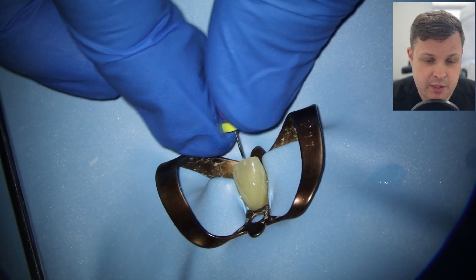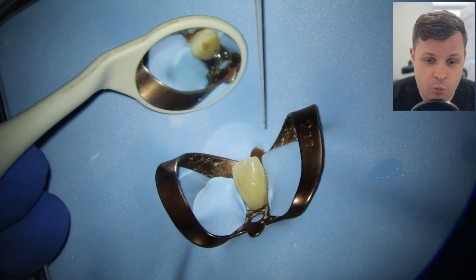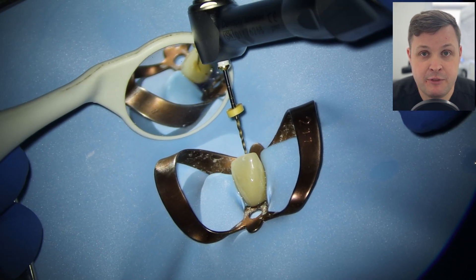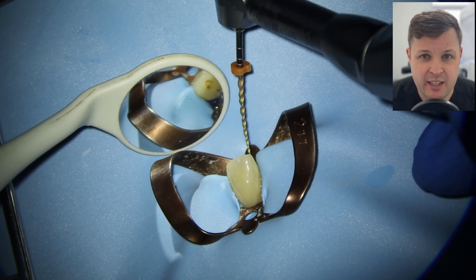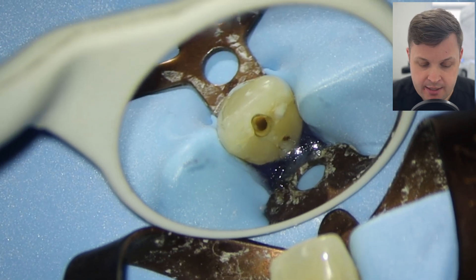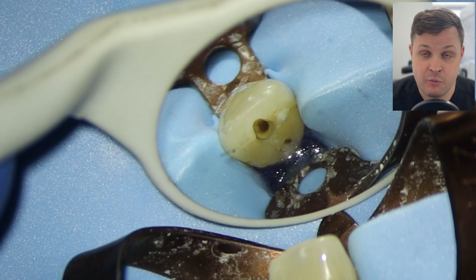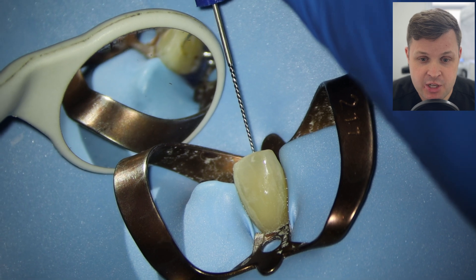Once I've confirmed the canal space is open, I'm going to use a size 10 K-file with a very acute bend on it just to get into the orifice, then use a watch-winding motion to open up the coronal orifice. Then I'm going to use my size Hyflex 1503 file to open up the orifice a bit more. If the coronal orifice isn't open before you get your working length, opening it afterwards will affect the working length because you're essentially shortening the length the file can reach to the apical end.